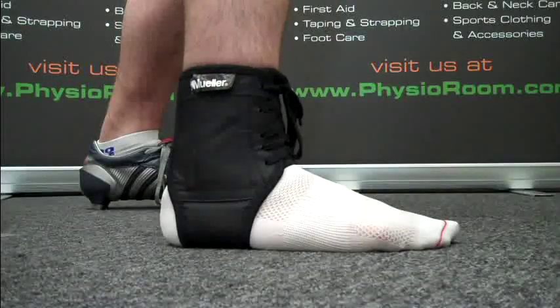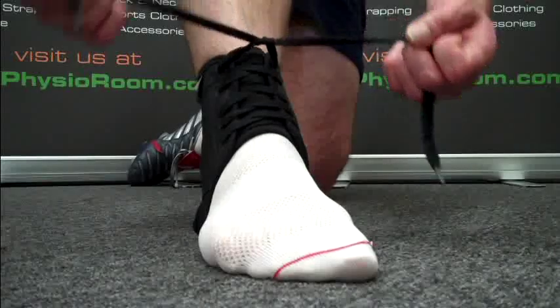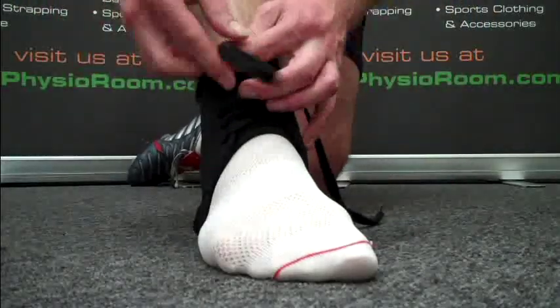The ankle brace should be worn over a sock. It is pulled onto the foot and laced up to give improved stability during sport.